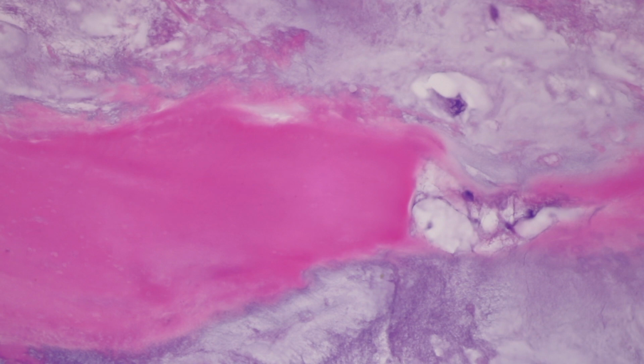So when I look at this pink tissue, the differential is: is this entrapped pre-existing lamellar bone, or is this some type of pink staining cartilage, or maybe something else? I can say it's not pre-existing bone: it doesn't have a lamellar architecture, I do not see lacunar spaces, so this is not pre-existing lamellar bone. And I have to find another reason to explain what this tissue is.